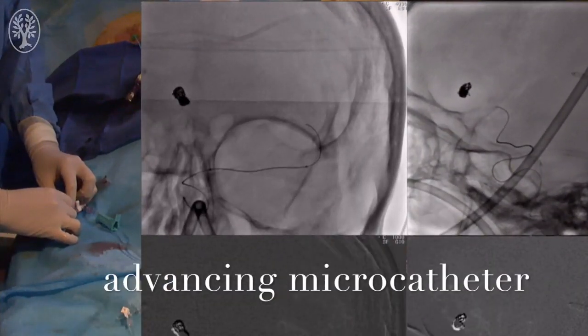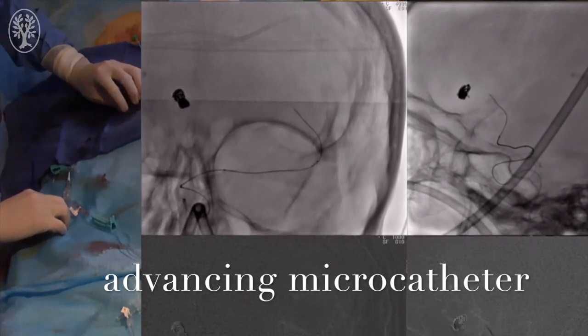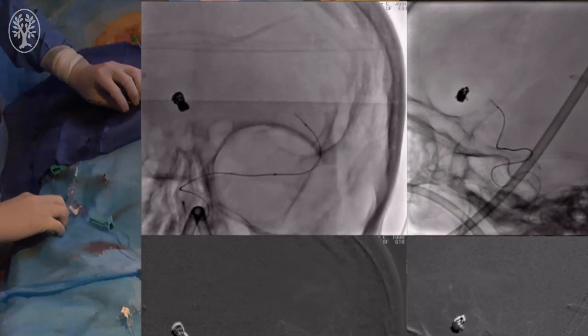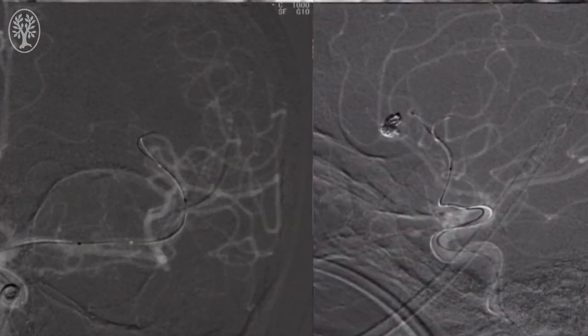On this view, we see the microwire and microcatheter being brought up into the distal middle cerebral artery. We're advancing the microcatheter over the microwire. A run here demonstrates the branch off of which the mycotic aneurysm occurs. We continue to navigate the microwire and microcatheter in the distal MCA.